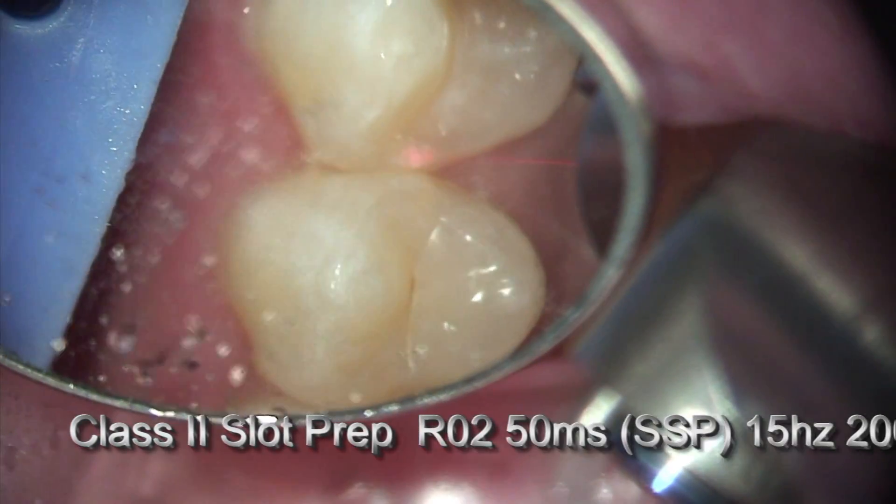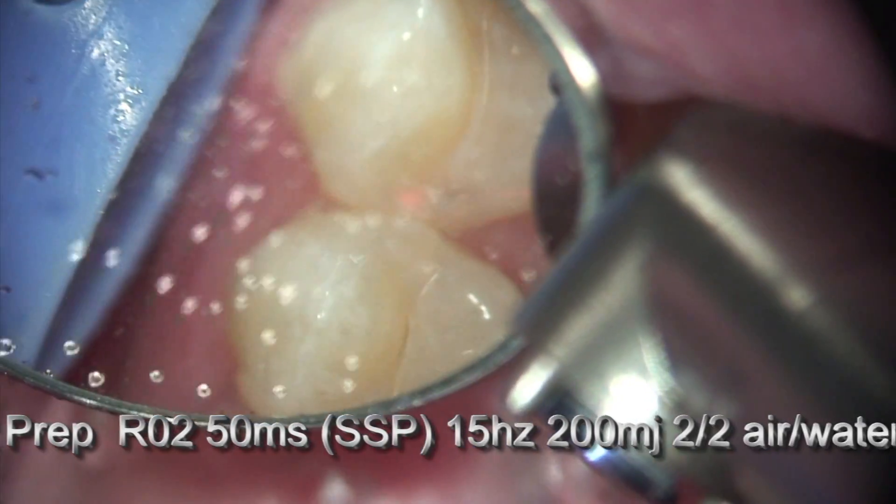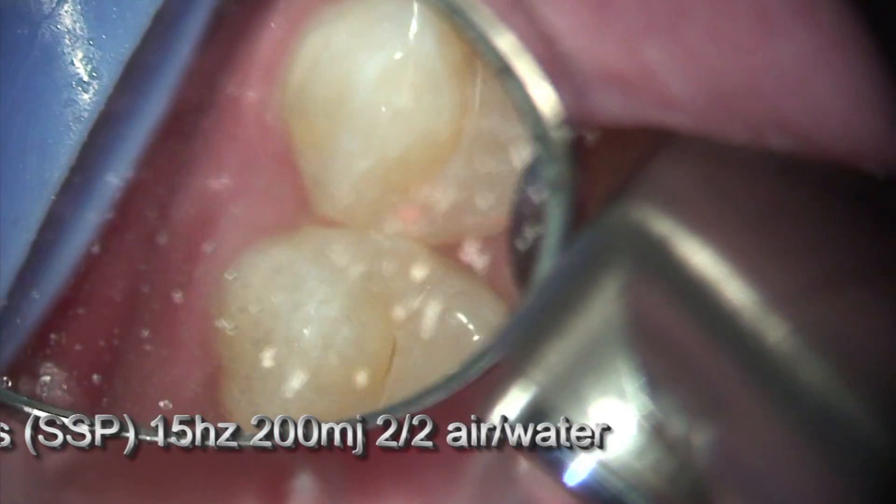Using the RO2 tipless handpiece with great visibility, I'm able to remove the marginal ridge quite efficiently and quite quickly.